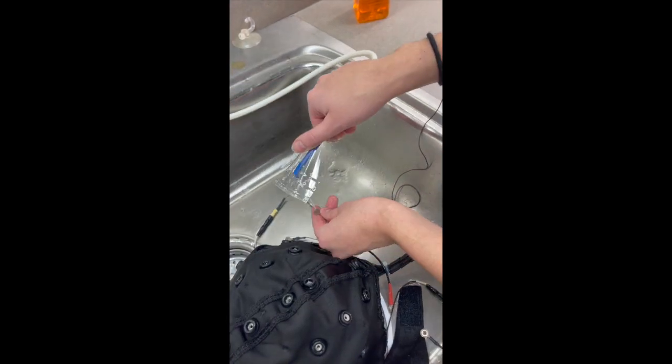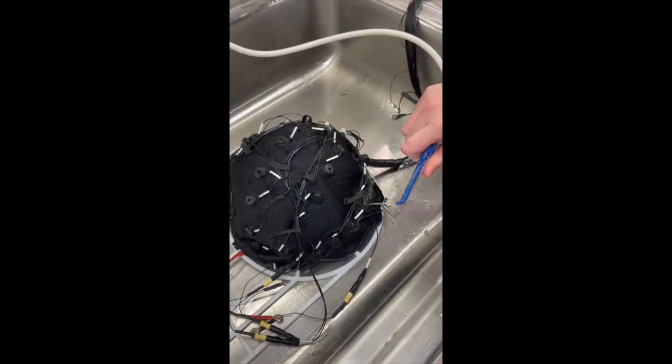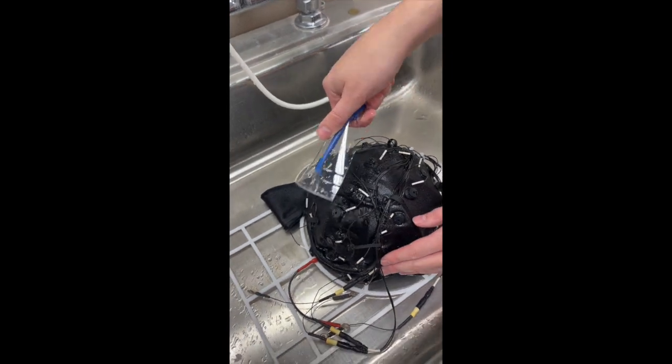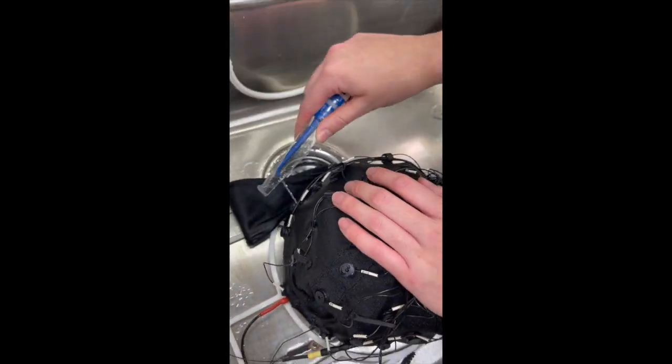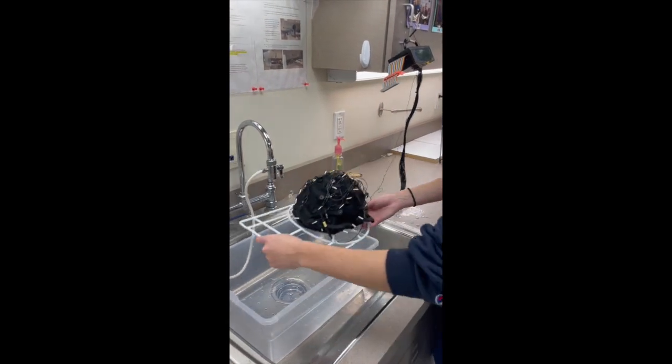Also use the jet to clean the reference and ocular electrodes. Turn the cap inside out to reveal the top of the electrodes and, once again, go row by row with the water jet to remove the gel clumps, making sure that you don't avoid any electrodes.